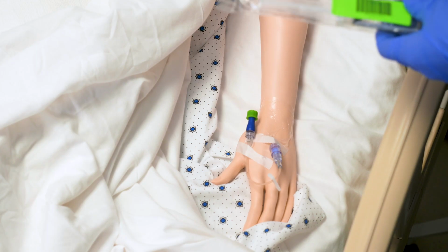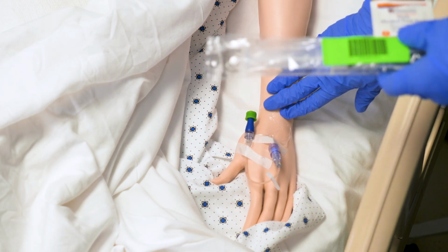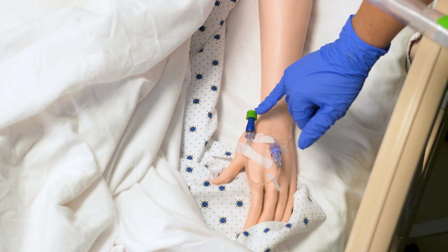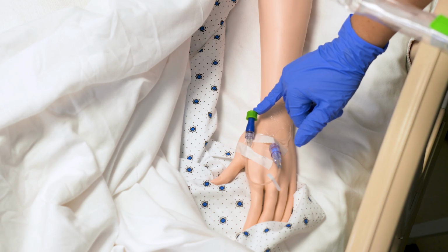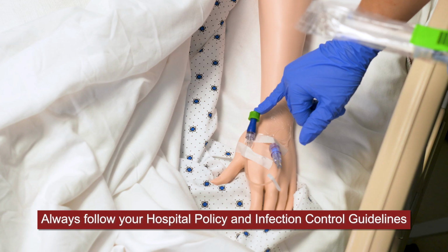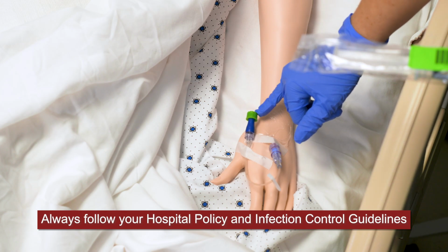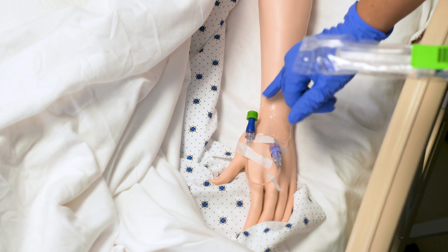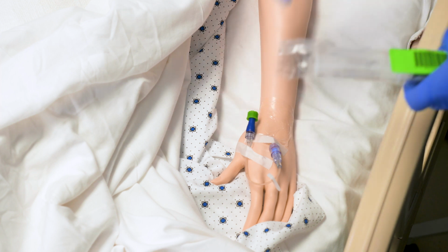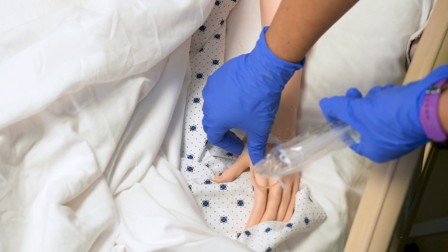So now we're going to get ready to flush Ms. Duncan's IV line to make sure that it is patent and working. You can see her line at the top here has what's called a Curos cap. It is an alcohol disinfecting cap. Some hospitals use them, some hospitals do not. We are going to follow the strictest guidelines for our area hospitals, which requires us, even when they have a Curos cap, to still scrub the hub, meaning you're still scrubbing the injection port with alcohol before accessing.